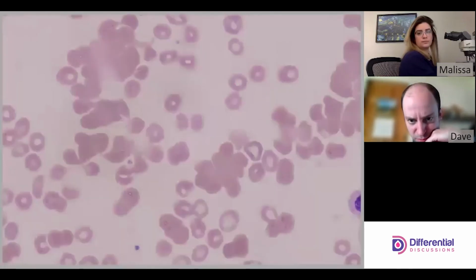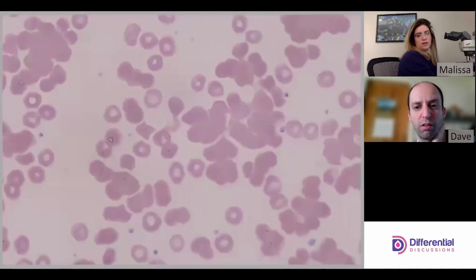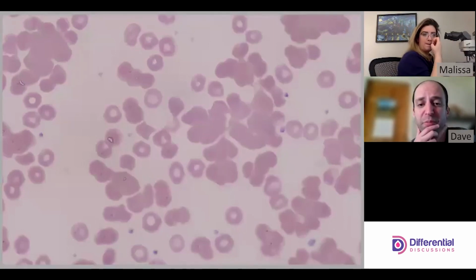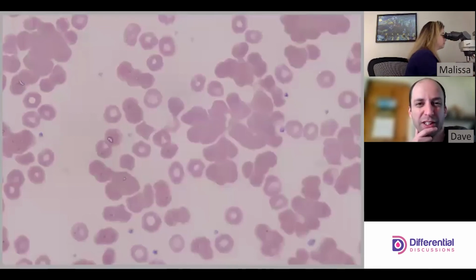There might be a little bit of polychromasia. I think I see a couple of cells, maybe. This one here looks like it has a bluish tint to it. But other than that, that one wouldn't be enough to call. No, certainly not. Agglutination, I think most of the time, is a qualitative finding. I would imagine someone may be able to put a plus scale on something like that if they really wanted to, but you just kind of say it's there or it's not.